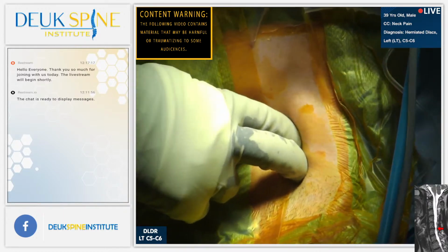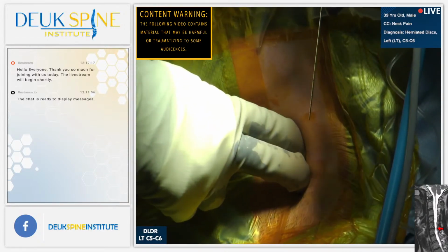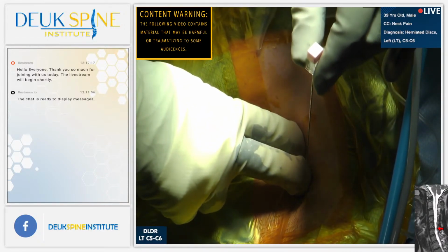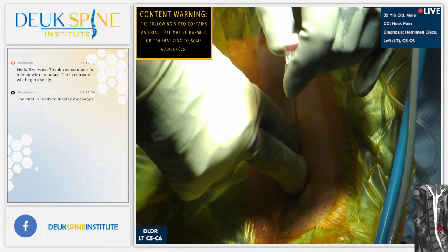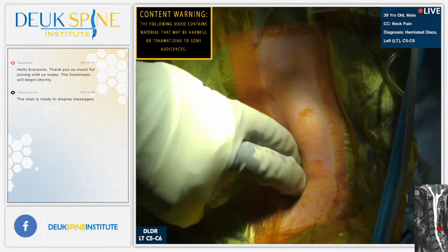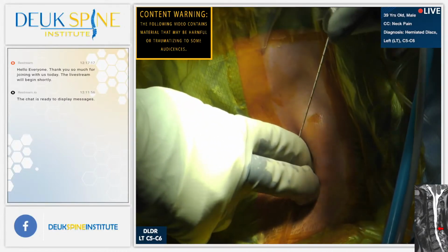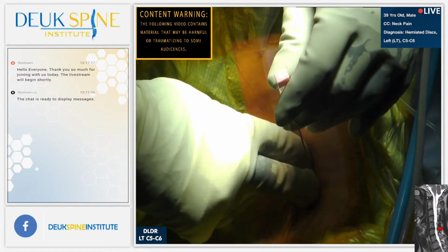So the first step in the surgery is to palpate the spine. Thank you, Dr. B. You want to feel the front of the spine with your fingers. Only possible when you actually have the patient relax. 2, 3, 4, 5, 6, we're a little low. So I can go up a little bit higher. He's got a big Adam's apple. What I'm doing is creating a space, but I can literally feel the spine right here. Shot.